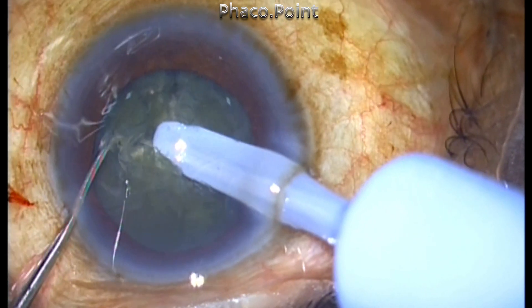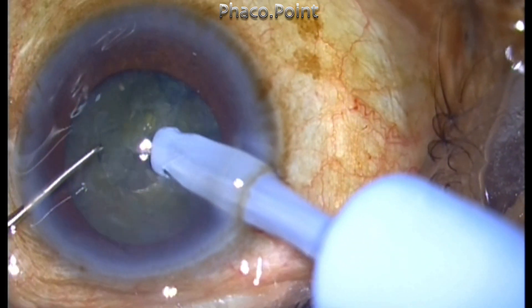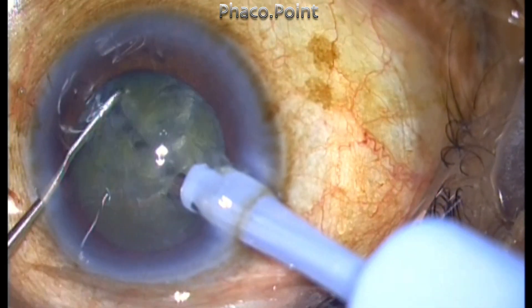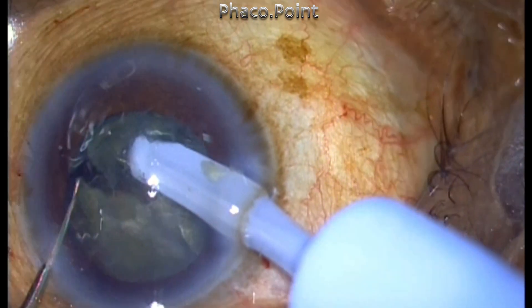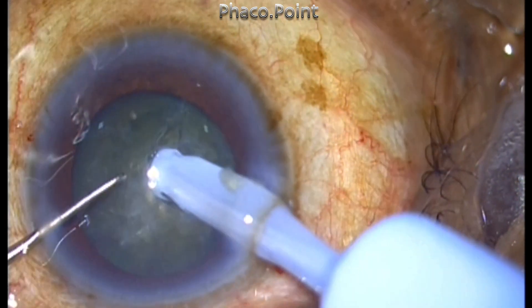It's important that you drive the FACO tip to sufficient depth before you attempt the chop. It's also important to ensure that the fragments created are separated through and through, right to the bottom, and that the middle and posterior plate is totally divided.